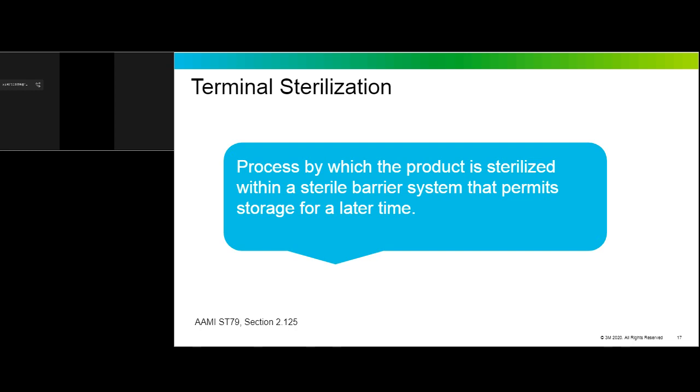And speaking of that sterility maintenance, most facilities follow an event-related concept. That means that you would consider an item that has been terminally sterilized to be sterile until an event, like, for example, the package getting torn or the item getting wet, compromises the sterility of that item.